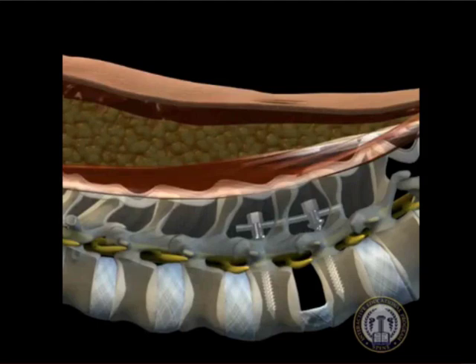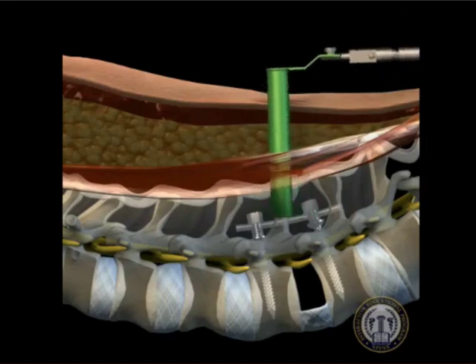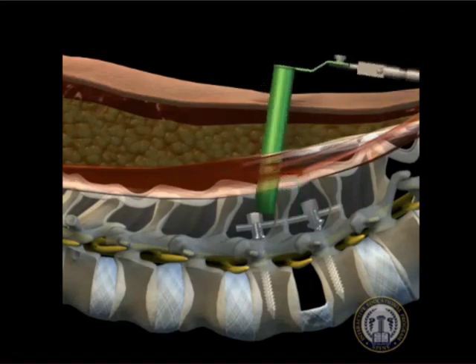If there is concern about contralateral neural element compression, then a direct decompression can be obtained by repositioning, or wanding, the ipsilateral tubular retractor, or by placing a second tubular retractor through the contralateral incision.